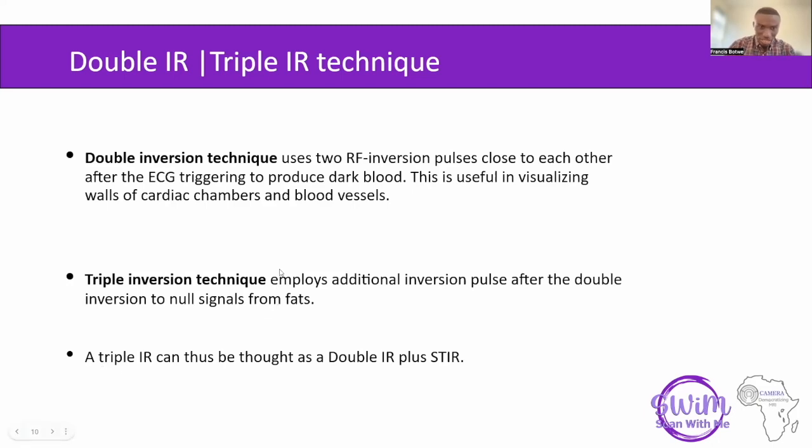So we are going to feed our computer or the parameters with two inversion times, which will suppress fat and at the same time suppress blood.